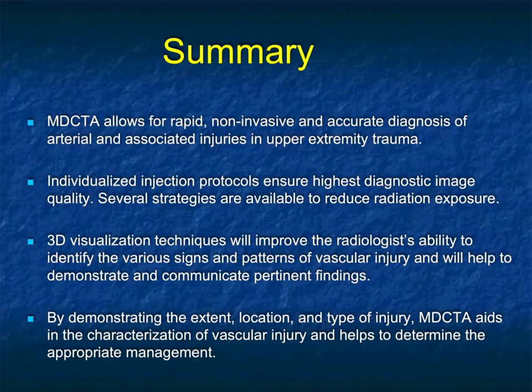extremity. Make sure you optimize your protocols. Make sure you use 3D imaging. And again, working closely with the ER folks, working closely with the trauma surgeons will improve your ability to do this well. And with that, I thank you for your attention.